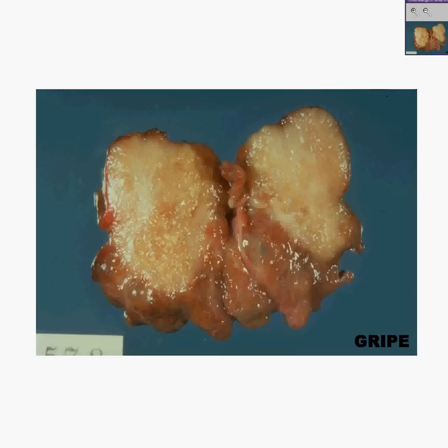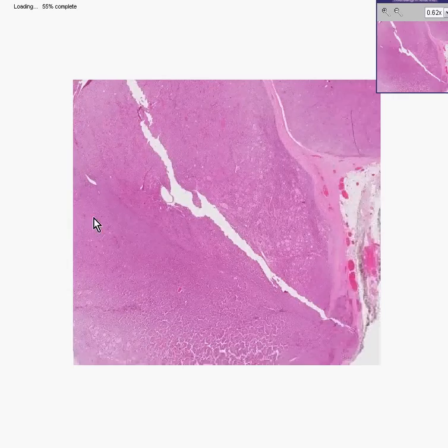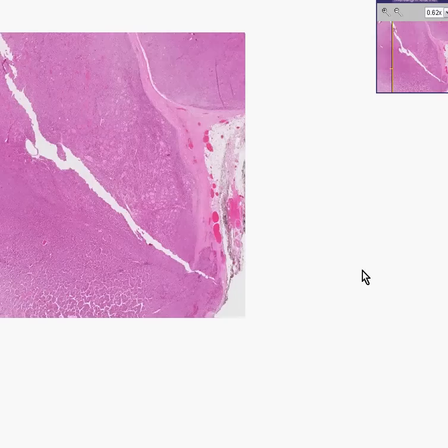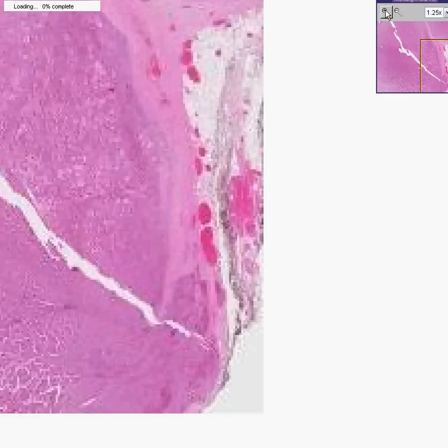Now let's take a look at this tumor microscopically. Here is the tumor, and here is perhaps the edge of the thyroid gland, which has been India inked to see if the tumor actually went to the surgical margins.